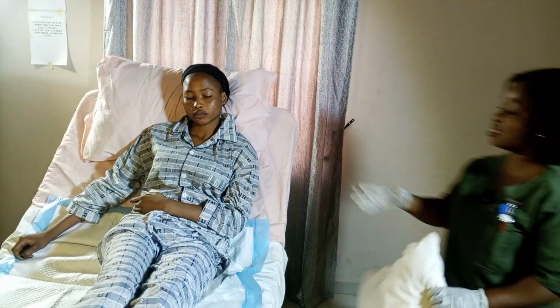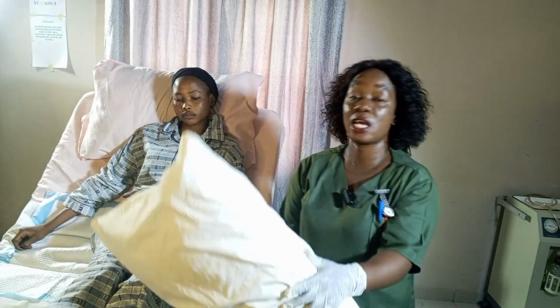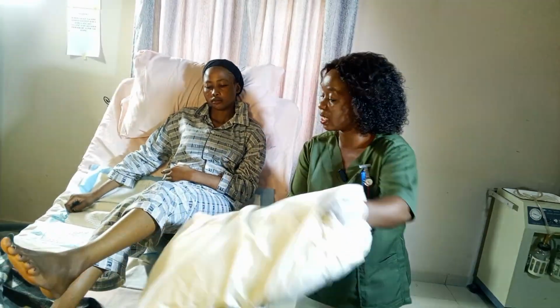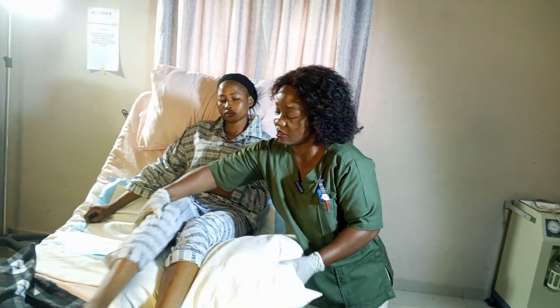And again, as you can see now, the patient is seated on the bedpan comfortably, and sometimes you can use an extra pillow to support the patient's leg so that the patient will not get tired, right?